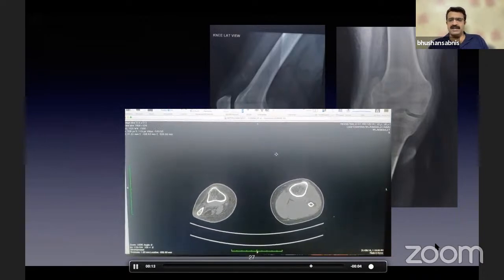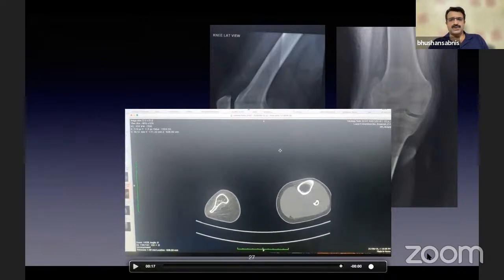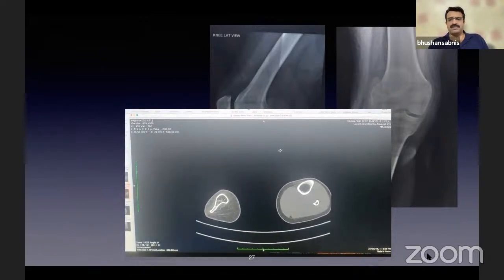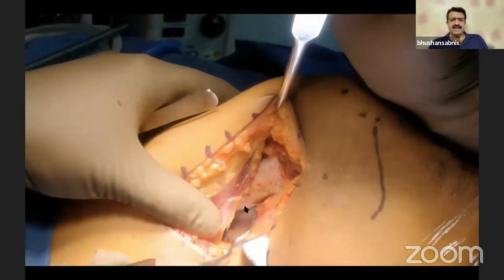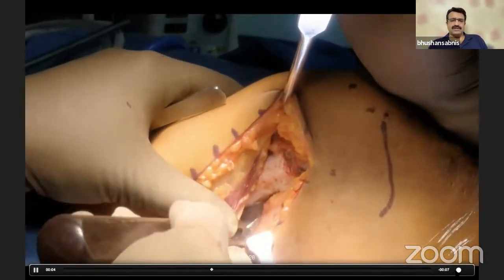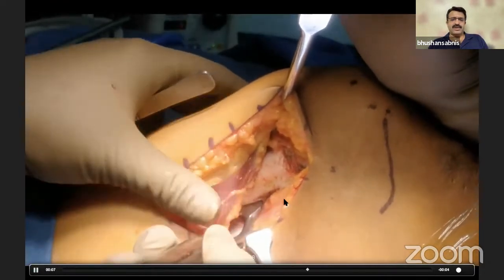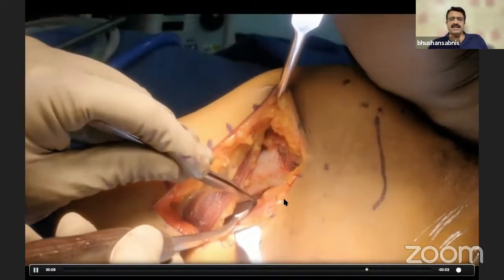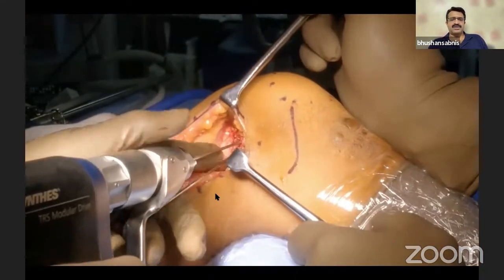There is some synostosis between the tibia and fibula from a congenital anomaly. Same principle, same approach: released everything on the lateral side. The lateral side approach is quite good, but the neurovascular structures are exactly there, so you need to take your time to clear the area properly, releasing everything down all the way to the medial side. Then pass your wires in the standard position.